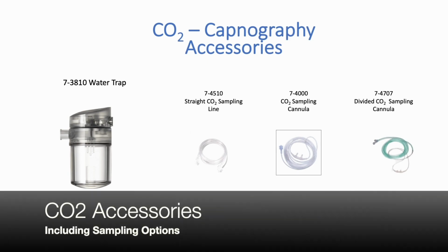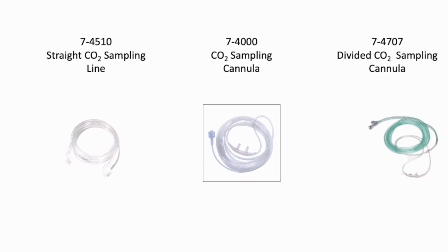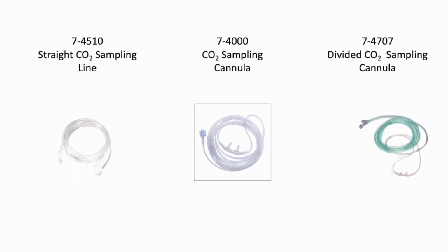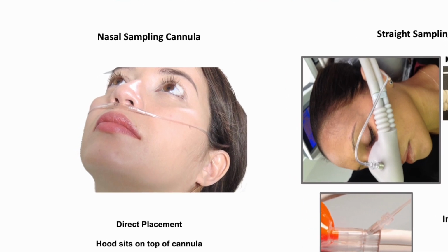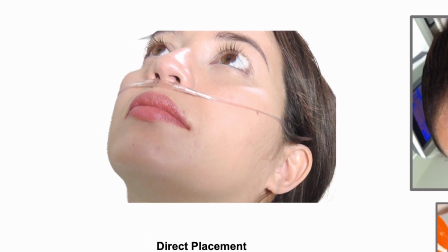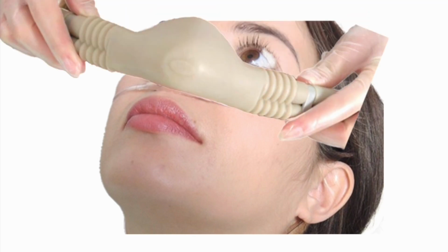CO2 accessories. These include a water trap and multiple CO2 sampling options: straight sampling line, CO2 sampling cannula, and a divided CO2 sampling cannula. Let's determine which one will work best for you. Do you deliver oxygen through a nitrous hood? The nasal sampling cannula is used to monitor CO2 independent of oxygen delivery. However, if you are delivering oxygen through a nitrous hood, this is the most reliable method. Place the nasal sampling cannula on the patient in the same fashion as an oxygen cannula, and then place the nitrous hood on top of it.